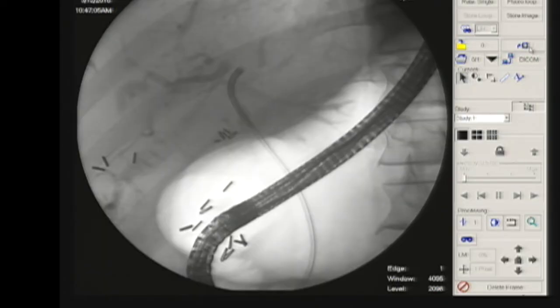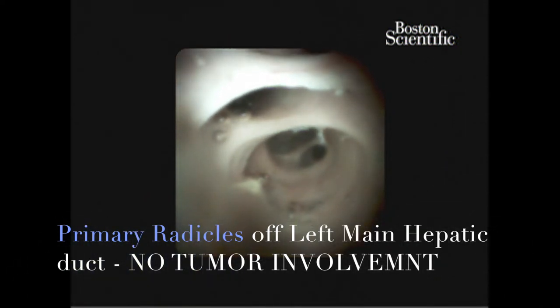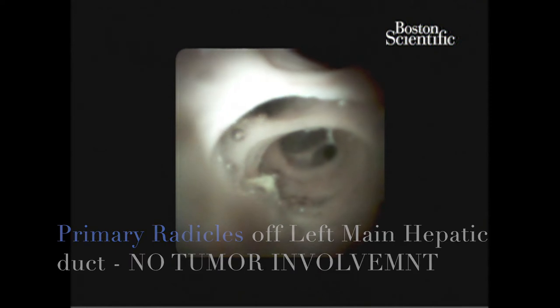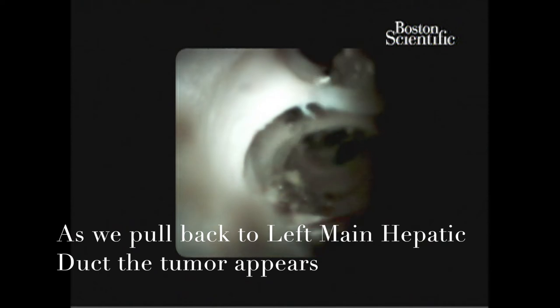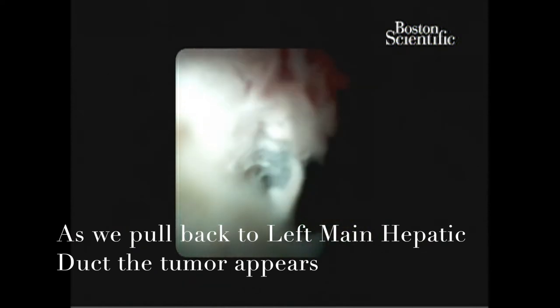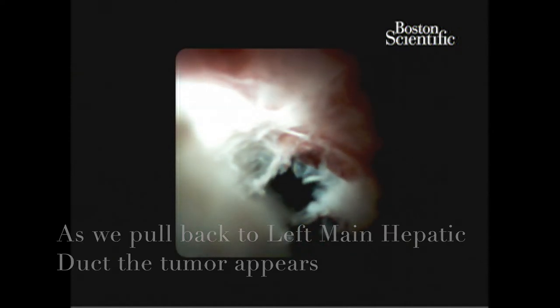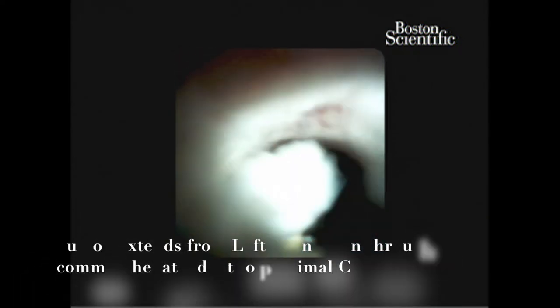Furthermore, when we pull back the scope, we're able to take a look at the primary radicals coming off of the left main hepatic duct. These are the areas where the left main hepatic duct first starts to branch, and there's no tumor involvement here either. As we pull back further into the left main hepatic duct, the tumor appears. Therefore, the tumor extends down the right system and then up just to the left main hepatic duct, but not to the primary or secondary radicals. This is the classic appearance of cholangiocarcinoma — a hypervascular tumor partially occluding the lumen of the bile duct.